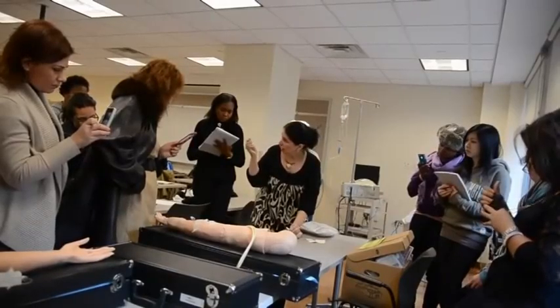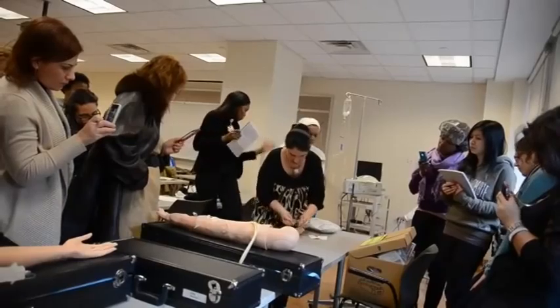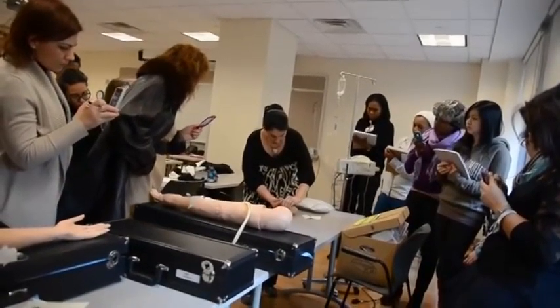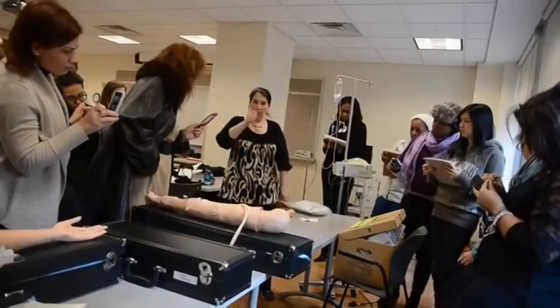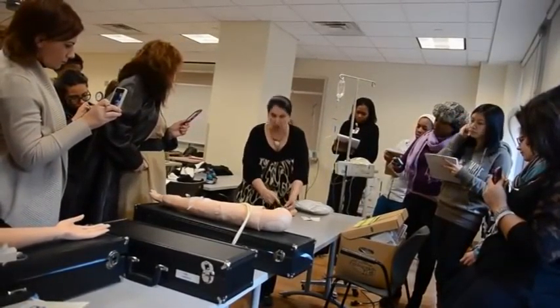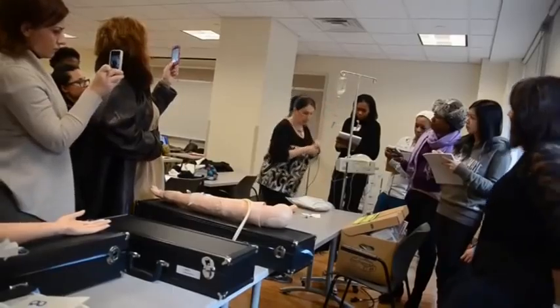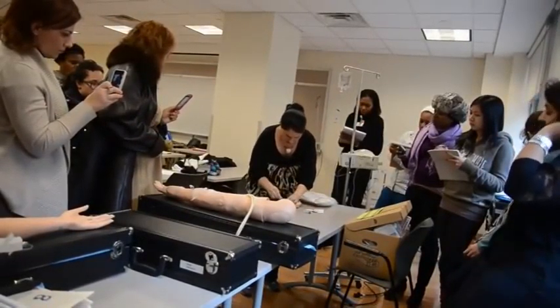Here's my saline flush — it's already here. I'm going to connect my flush. I'm going to open the clamp, flush it, and then close it. So I opened it to flush it. I closed it, and now I'm going to take it off — I can because I closed it. Now I'm going to come over, take my antibiotic, clean it again, and connect it.